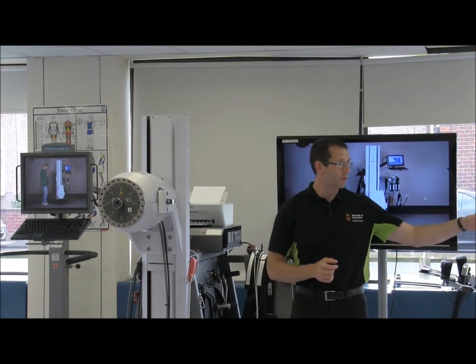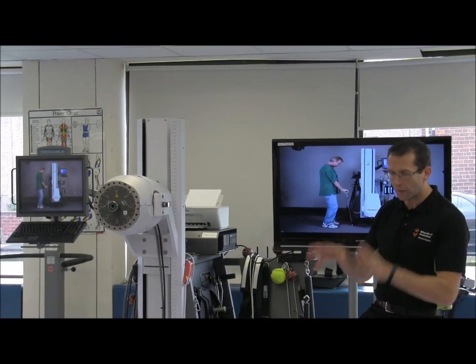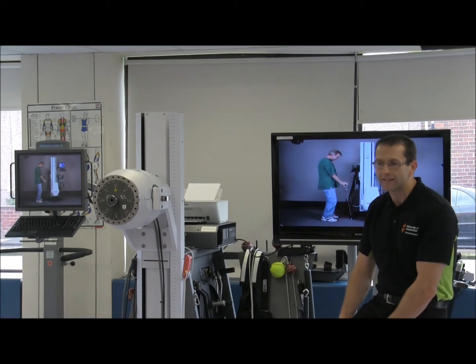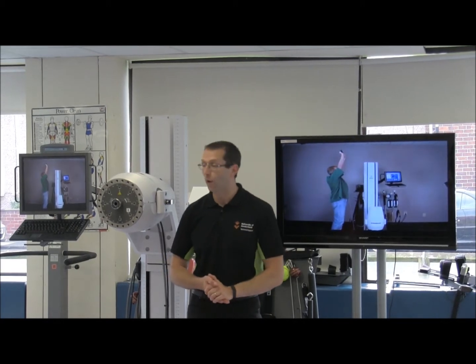For those of you that have used these systems before, they are very much a fixed track. So if you're looking at the knee joint, you would isolate that, lock the person in position, and then you would extend and flex the knee. The argument against that is how functional is that in terms of how we actually move around.